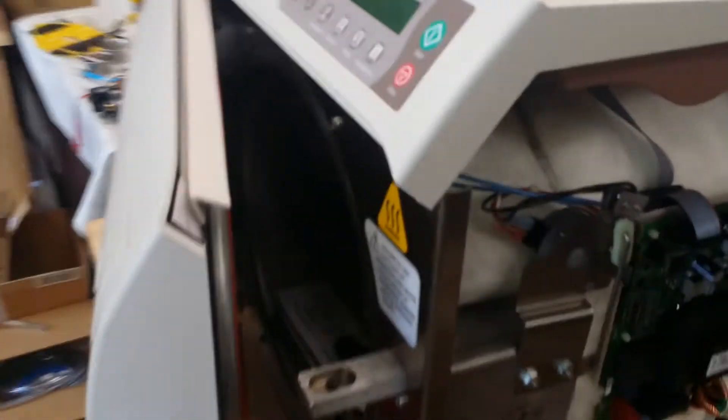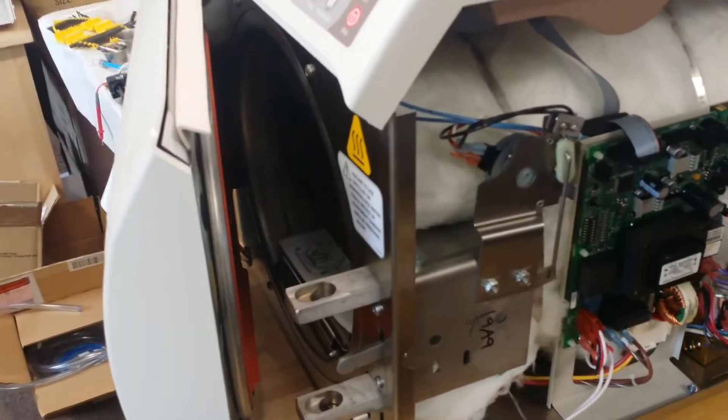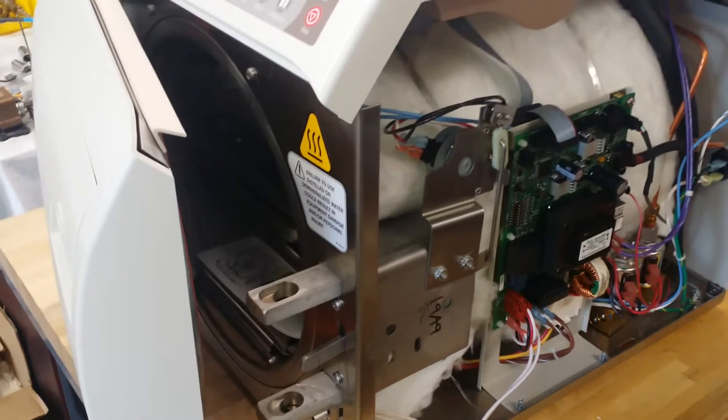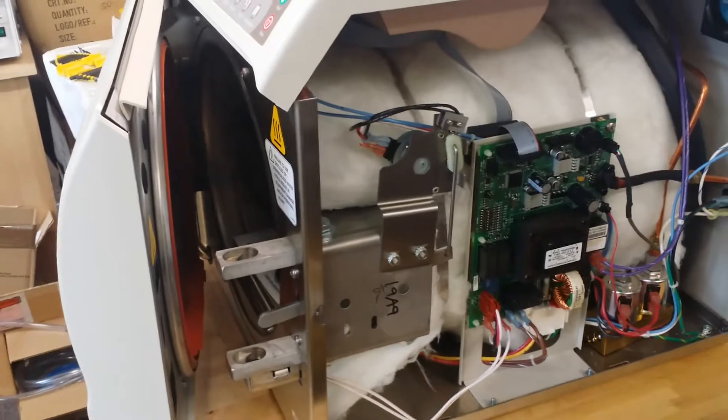The second number tells you what happened — is the temperature too low, is there overheat, or whatever. The last digit tells you when the sterilizer problem happened: is the sterilizer in sterilize mode, in heating mode, in dry mode — at which point in time.